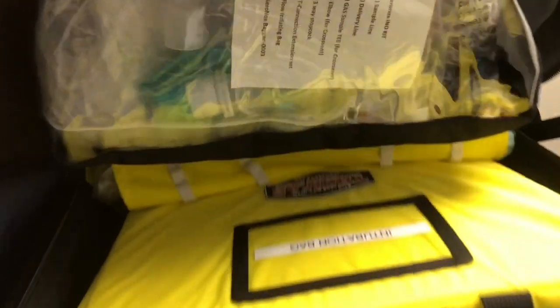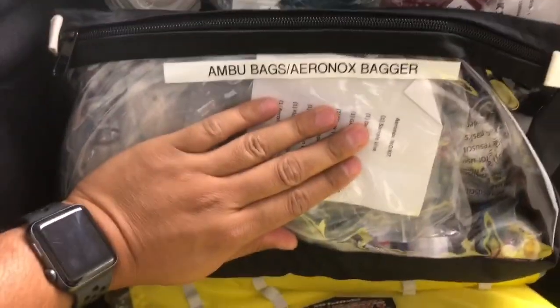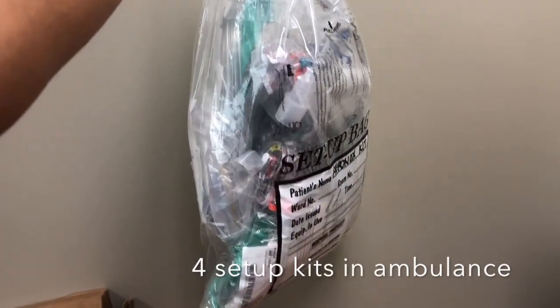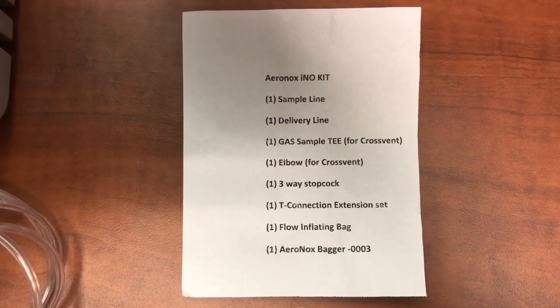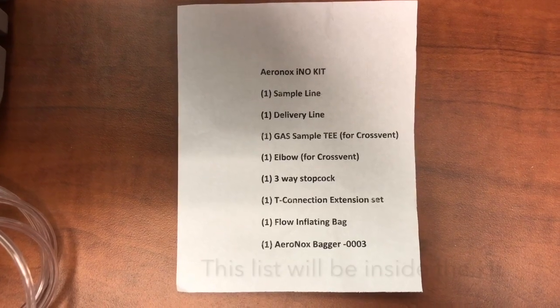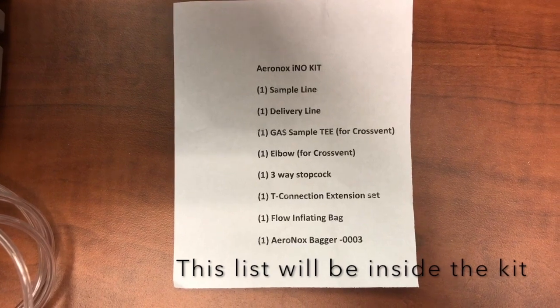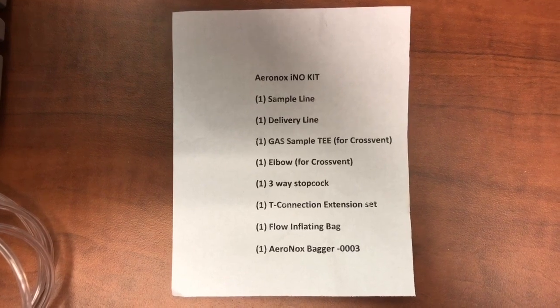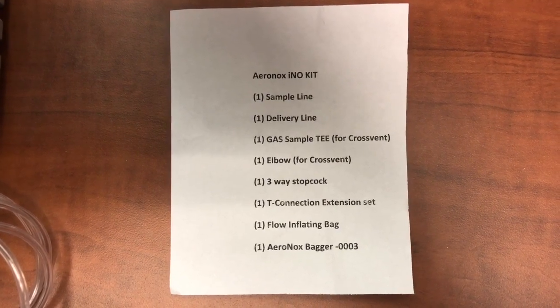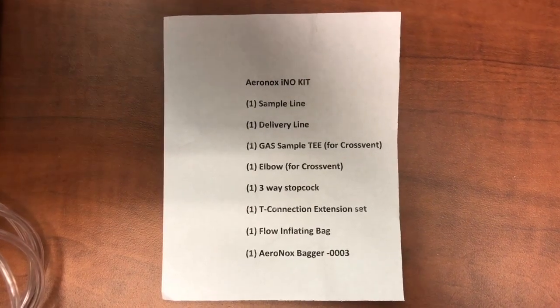Inside your bag, you're going to have your kit right here. There are four kits — we're going to put them inside the rig on the top compartment where all the circuits are. The kit includes: one sample line, one delivery line, one gas sample T for the cross vent, one elbow for the cross vent, a three-way stopcock, a T connection extension, a flow inflating bag, and an Aranox bagger.